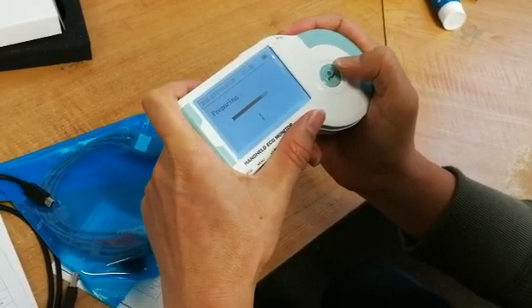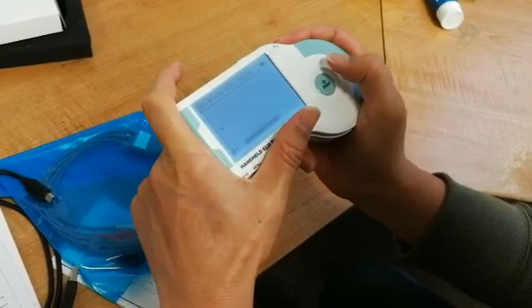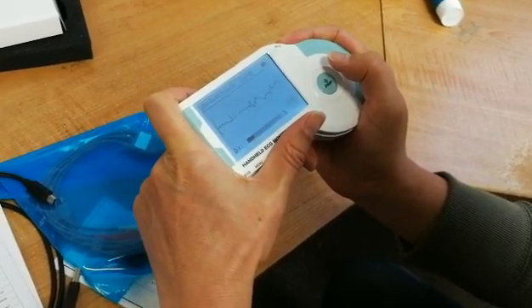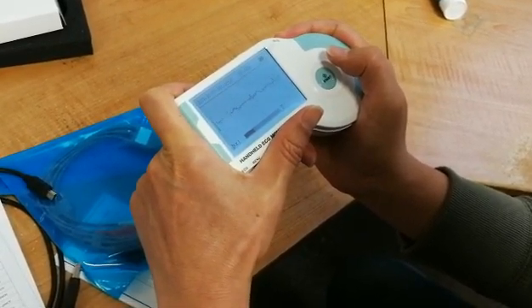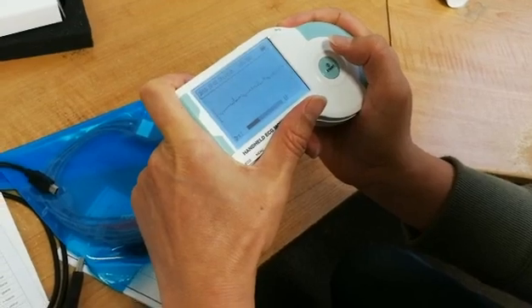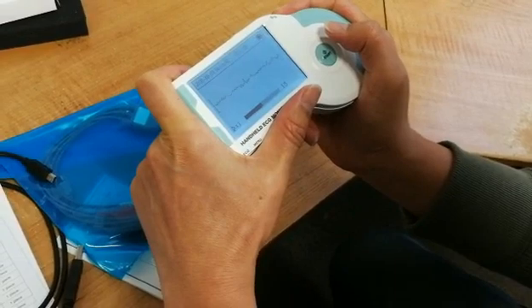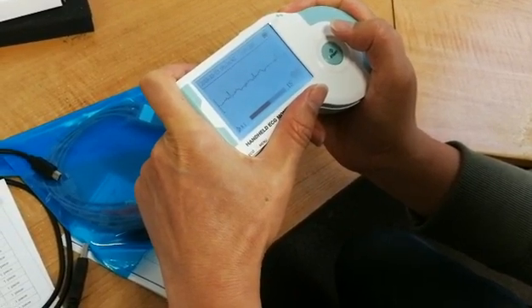Following pressing the start button, a 30-second ECG waveform reading will commence. This ECG waveform reading will give you a self-evaluation analysis at the end, and can detect early heartbeats, missed heartbeats, and irregular heartbeats as well.